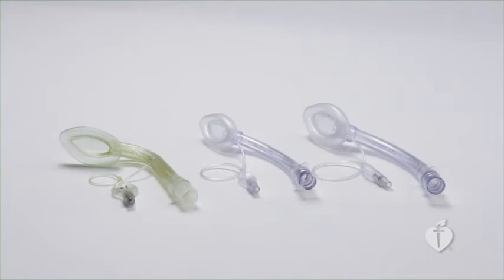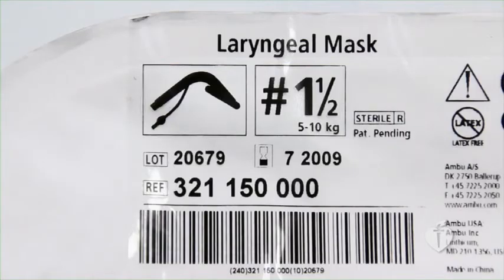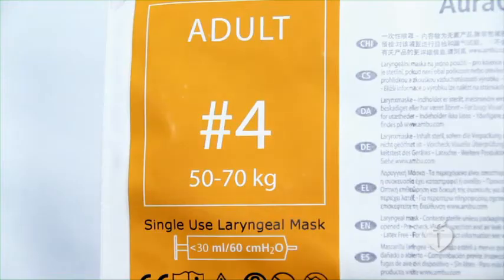The laryngeal mask airway is a supraglottic airway device consisting of a tube with a distal inflatable mask. It is inserted blindly into the hypopharynx and it sits above the glottis. It can be inserted without interruption of chest compressions. Laryngeal mask airways are available in a variety of sizes. The correct size is based on the patient's weight. Weight ranges appropriate for each airway are printed on the package, on the device, or both.